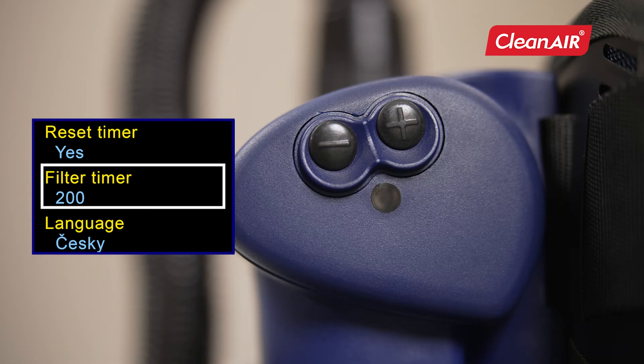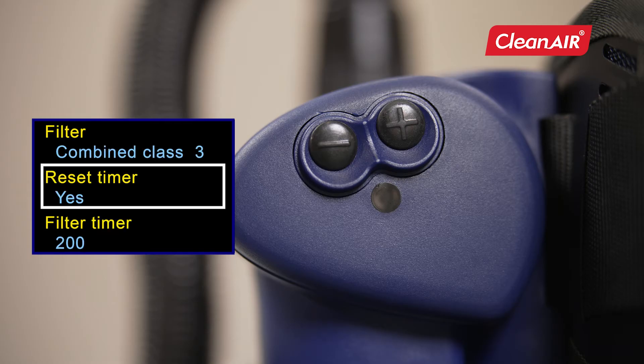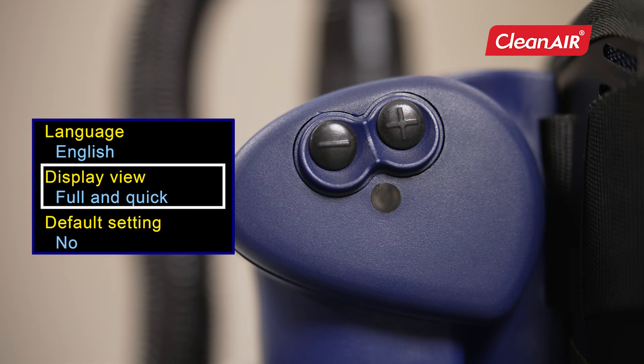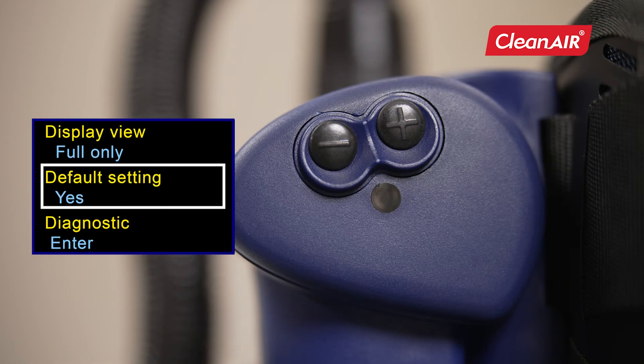When replacing new filters, you only reset the filter timer. In the language settings, you choose the language you want. The display view menu allows setting the display of complete information about the selected head top, filter, and current airflow, battery status, and filter life — or only information about the value of airflow, battery status, and filter life. The unit can also be reset to factory settings.